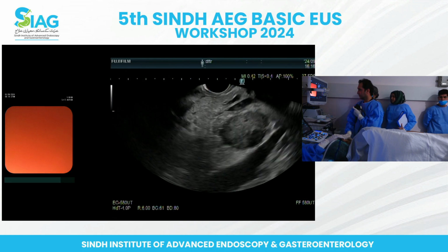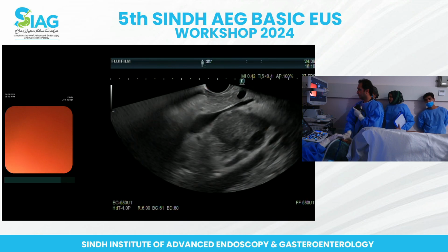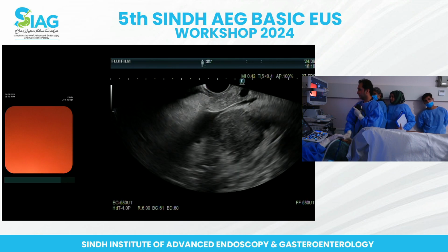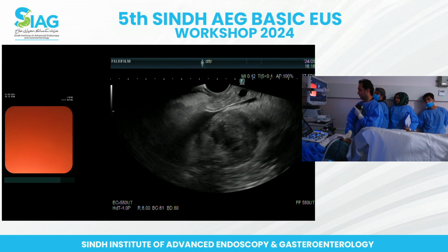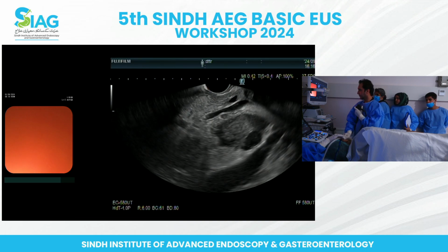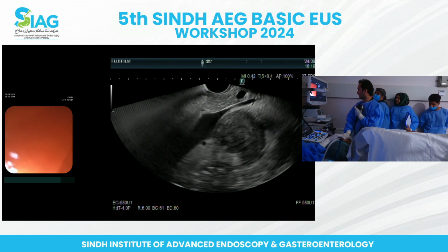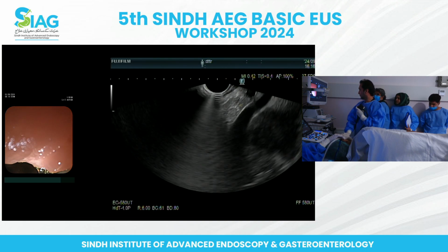Okay, very nice. Okay, good. So let's see if we can have a look from D1 again. So we established that from GOJ we won't be able to biopsy it. We won't be able to biopsy from the D2, station 3 as it were. So let's see in the D1.